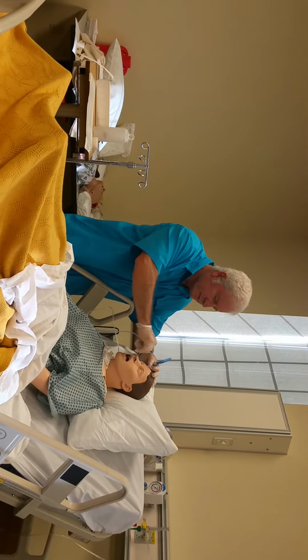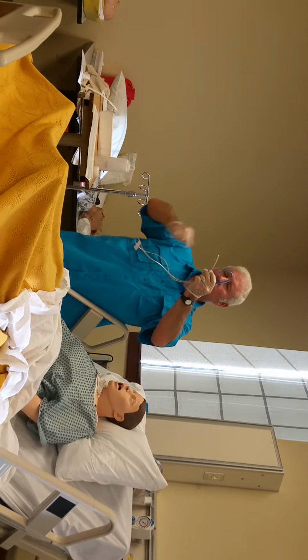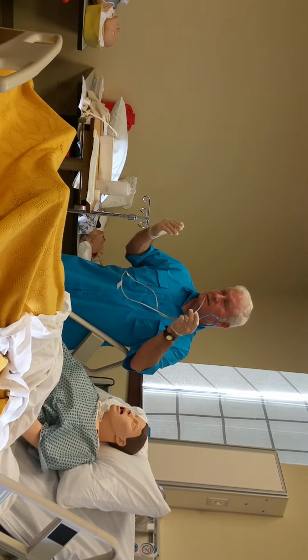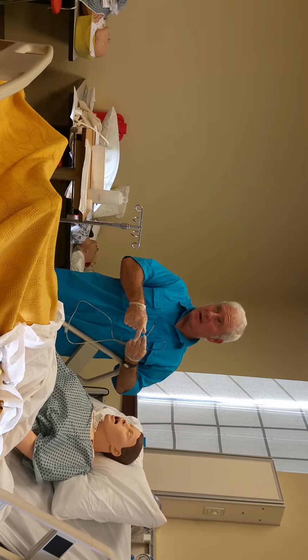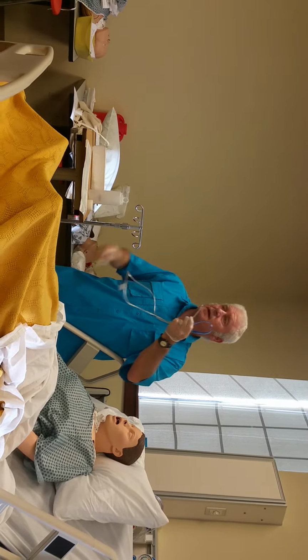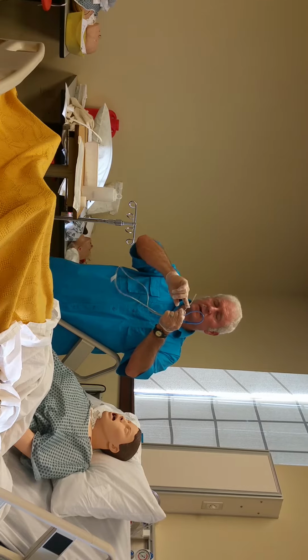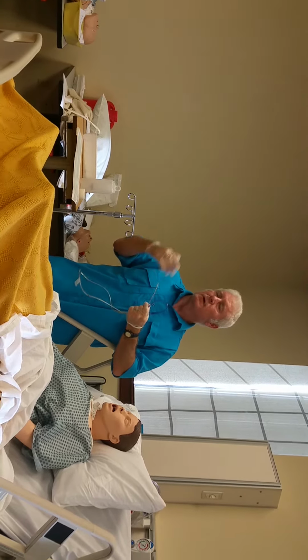I'll go ahead and take this off. We don't need it anymore. But you got these holes here. If you don't get the medicine crushed up really good, it'll start clogging around these holes, and now all of a sudden we've got a clogged up NG tube. I wouldn't want to have to go through having somebody pull it out and put a second one in because they messed up and they didn't do their job and they clogged up. Same thing with feeding. It's thick liquidy stuff, it'll get crusty, and that's why we flush it, but it can get crusty and build up around these holes, and all of a sudden we got a plugged up NG tube. We don't want that, okay?